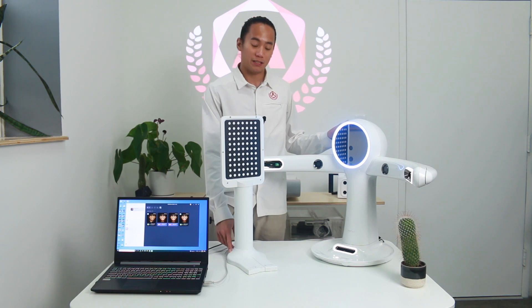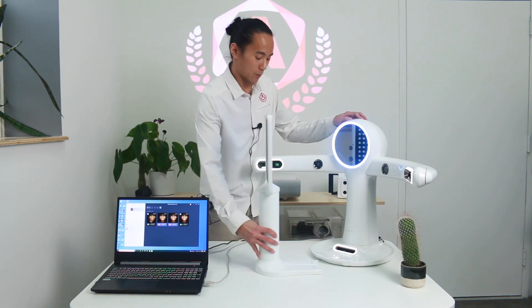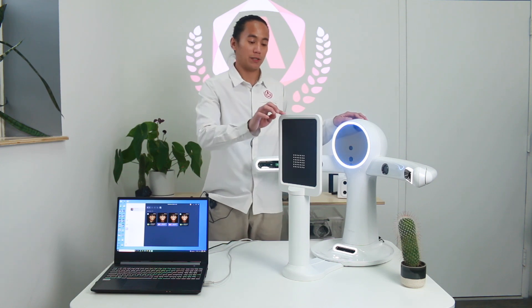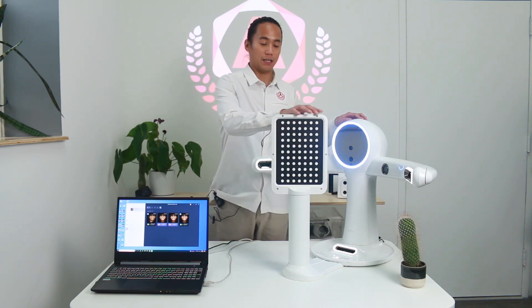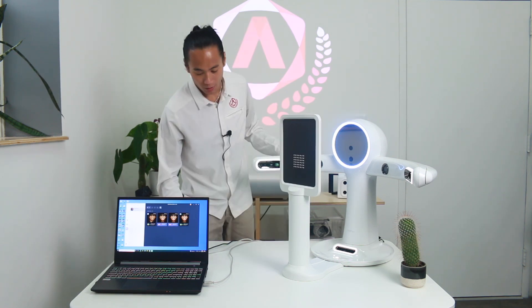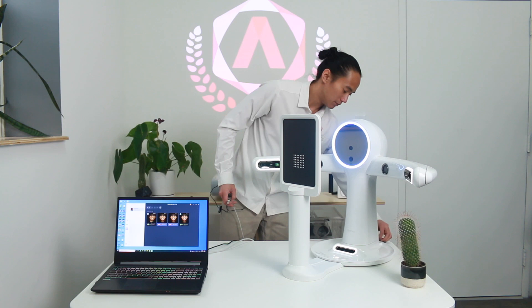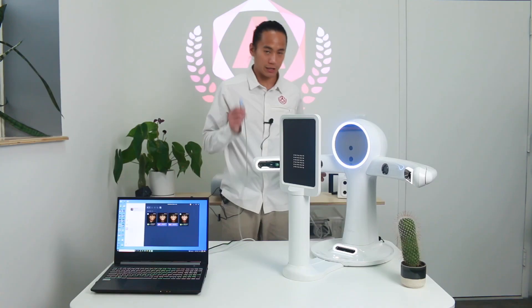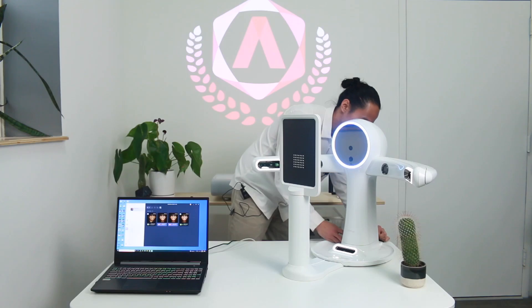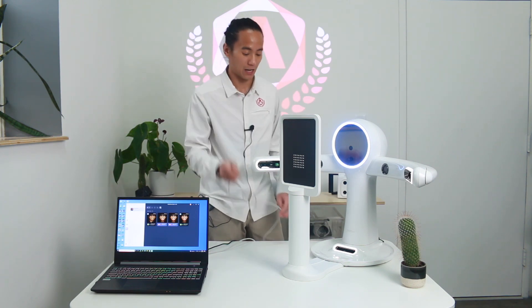On the calibration plate, you'll notice two arrows indicating the direction it should face. Slide the calibration plate into the base of the scanner, facing the camera connection side into the camera. Then take the USB cable that was originally connected to the scanner, plug the USB side into the calibration slot in the back of the scanner, and plug what was originally in the scanner into the calibration stand.